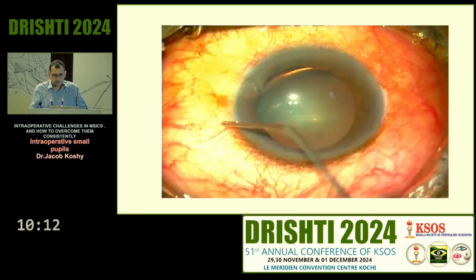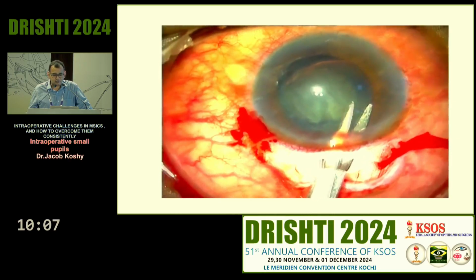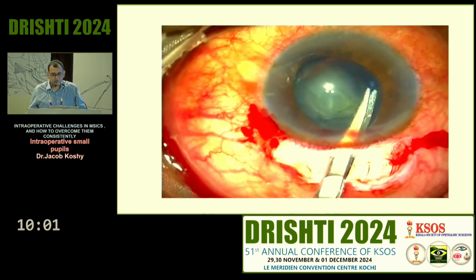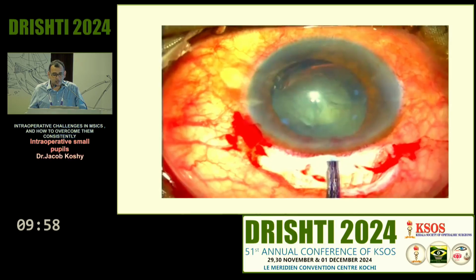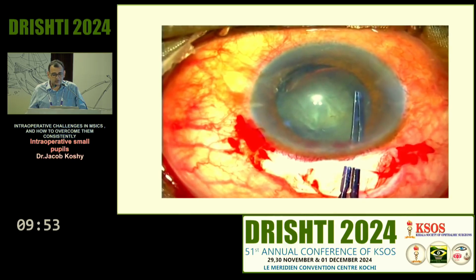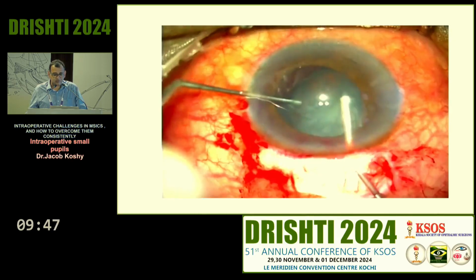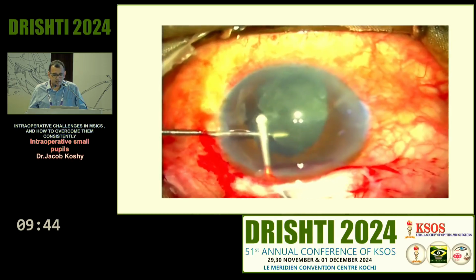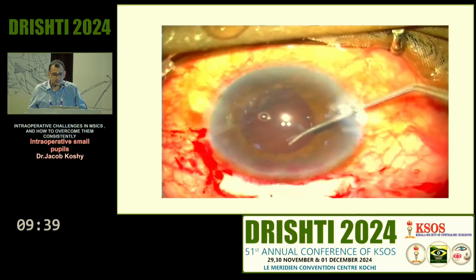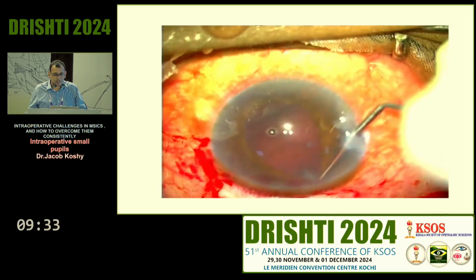Okay, so this is another patient now. Here there's a little bit of subluxation pre-existent with some vitreous. Make a small rhexis. We've already heard how to do that, and after you make a small rhexis, you want to just extend the wound. Here you already have a little bit of vitreous there, and inferior about 4 or 5 clock hours of subluxation, and I'm just trying to see if I can salvage it and put in a lens. Now, getting the nucleus out is the trickiest part. If you can manage without extending your subluxation, then you're good. Always keep checking to see if the other areas are okay and the extent of subluxation.